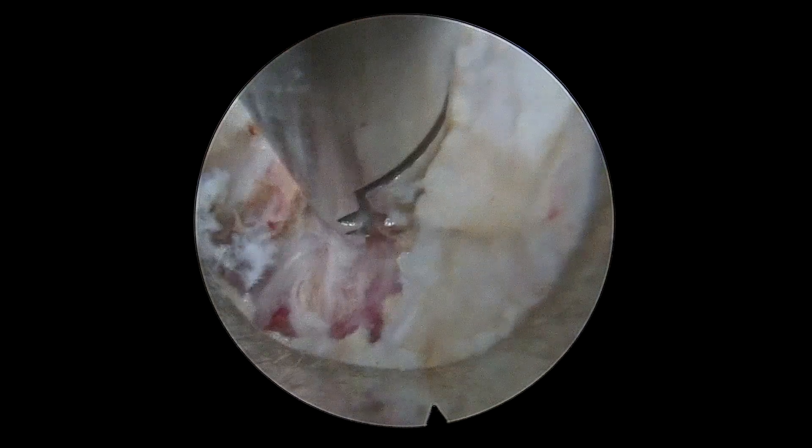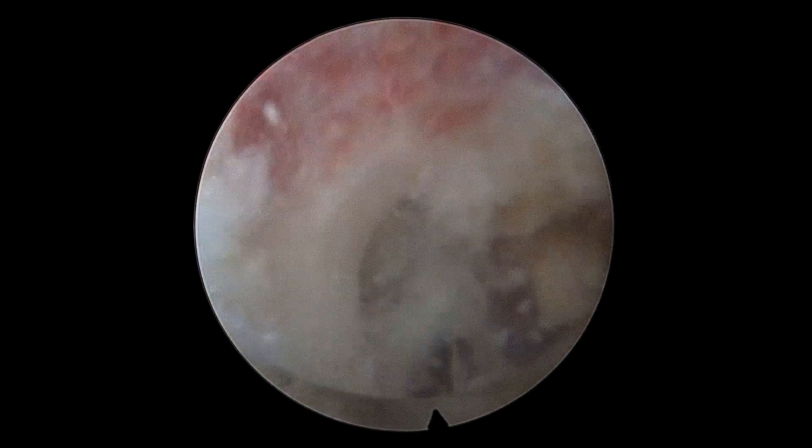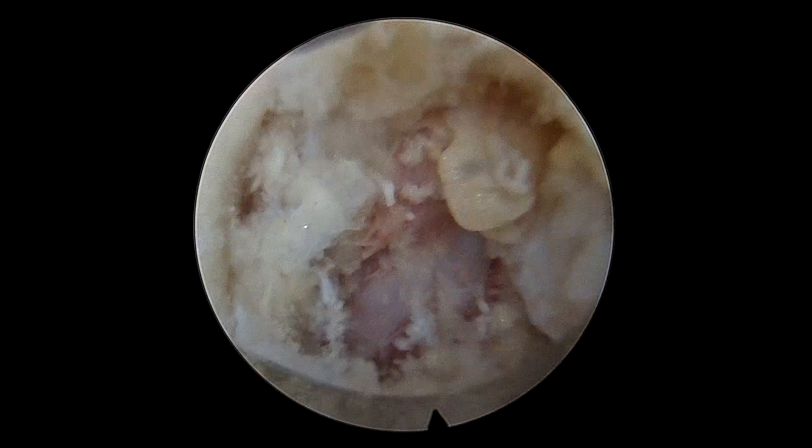It was extremely inflamed, red and angry looking. To create more space, we drilled part of the transverse process as well as the superarticular lateral margin.